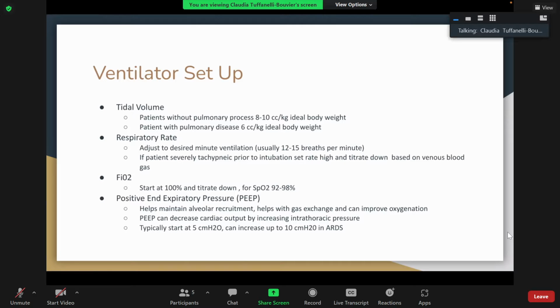That minimizes the release of reactive oxygen species and things that can cause damage. So having an oxygen of 100% can sometimes cause damage, so we don't love to see that. I want it a little bit lower, like 92 to 98. But it's a question to ask: see what your walls are. In some rooms, like just the trauma bays, the oxygen is titratable for the ventilator. And hopefully you can have somebody help you with that, but you can titrate that down.